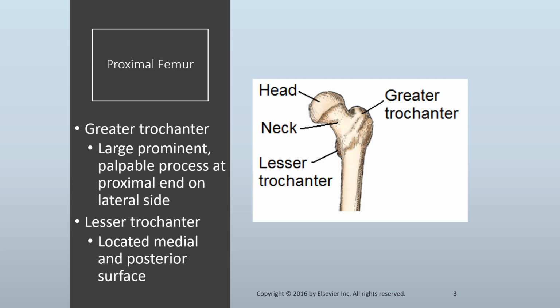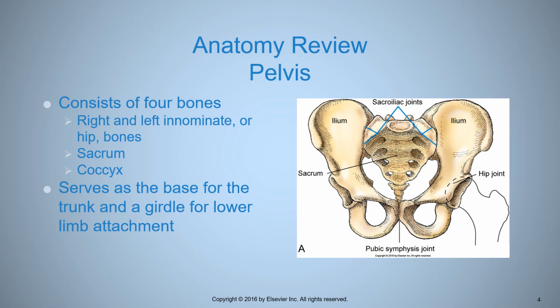It's on the medial side, but it's more posterior than it is true medial. Okay. Same for the greater trochanter. The greater trochanter is slightly more posterior than it is true lateral. Okay. And so it kind of crowds the femoral neck unless we do some manipulations for the AP hip. So we're going to see that we're turning the toes in for that AP hip. Okay. In between the greater and lesser trochanter on the posterior aspect of the femur is the intertrochanteric crest, which is just a ridge or a prominence connecting the two trochanters.